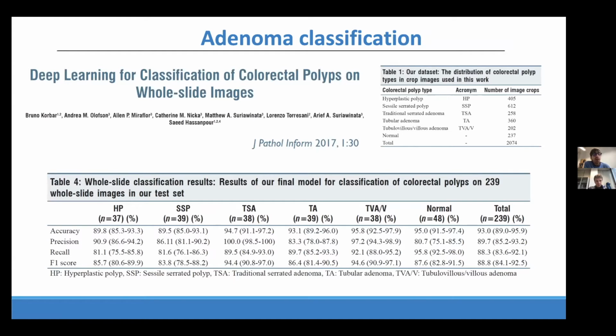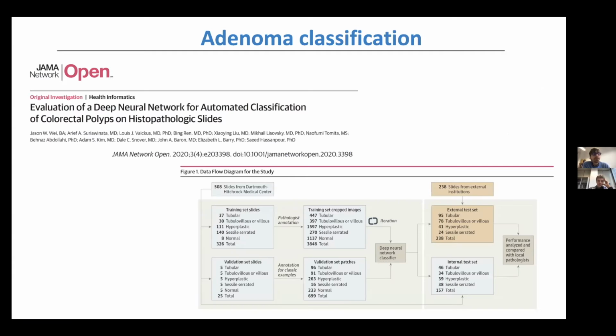The first one was, for example, the comparison between high-grade and low-grade dysplasia. Here you can see that they compare the different architectures, tubular, tubulovillous, in this case also some other serrated lesions. But for this tool, they have not considered the grade of dysplasia. This was an important limitation because the tool would not be able to replicate the pathological diagnosis.